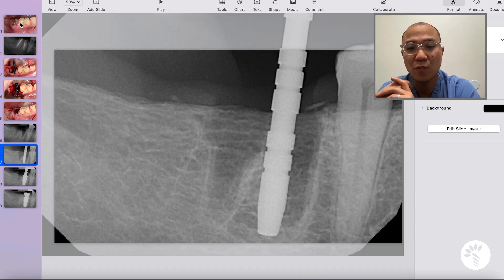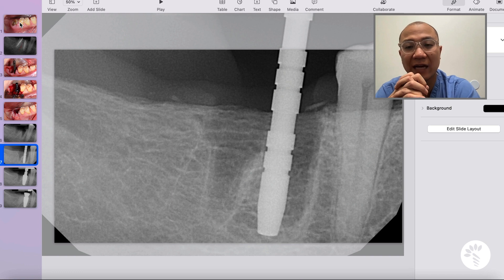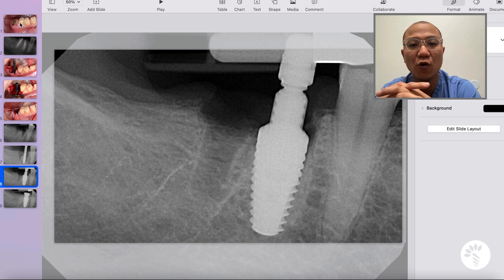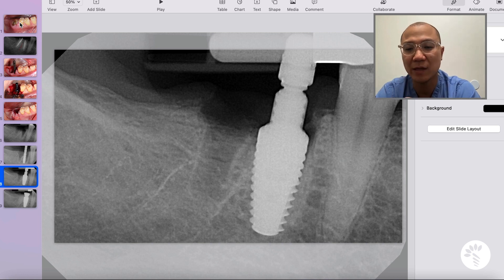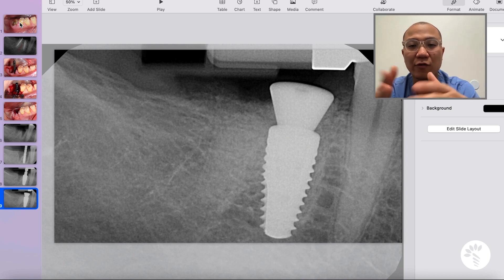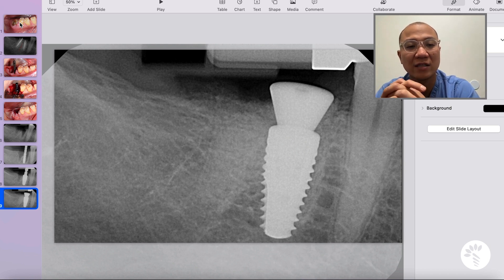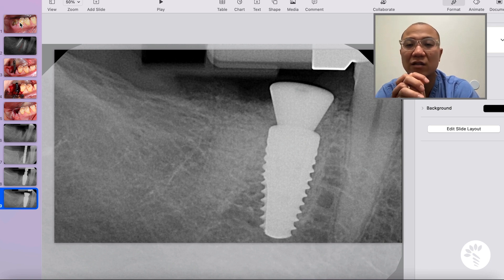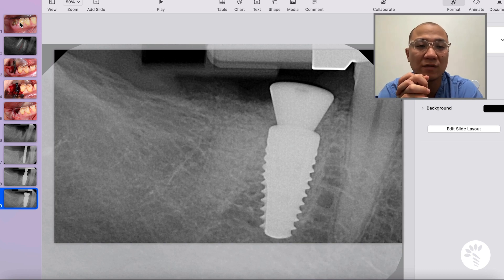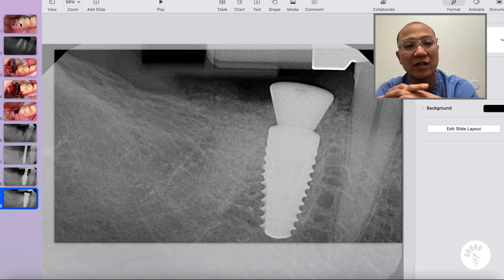This is with the initial guide pin after initial osteotomy, and this is after I placed the implant. The size of this implant is 4.8 mm by 10 mm. After that, I placed the healing abutment and then grafted the remaining socket with FDBA, a cross-linked collagen membrane, and a biologic modifier — in this case, platelet-derived growth factor — which was used to hydrate the FDBA.